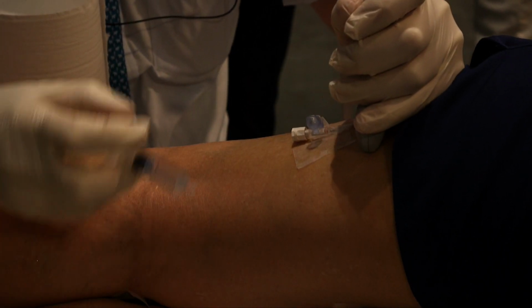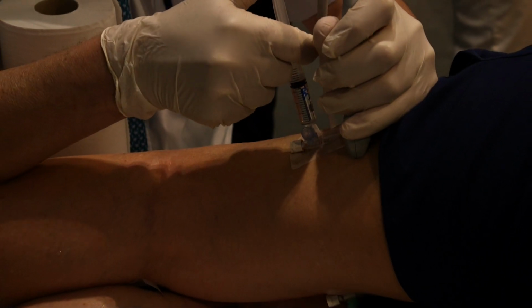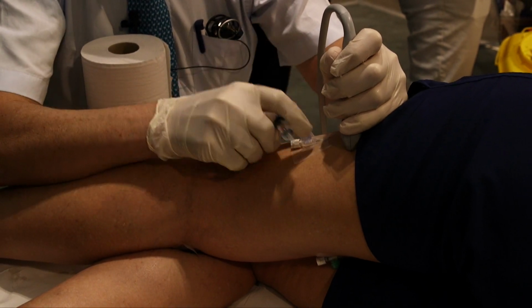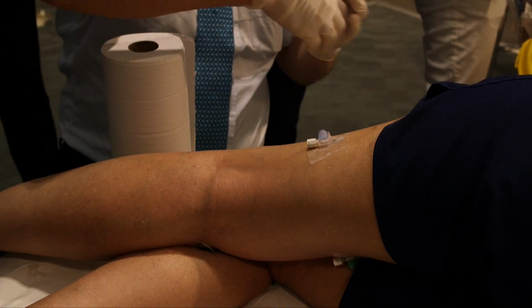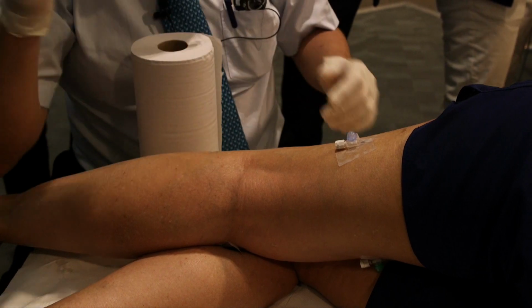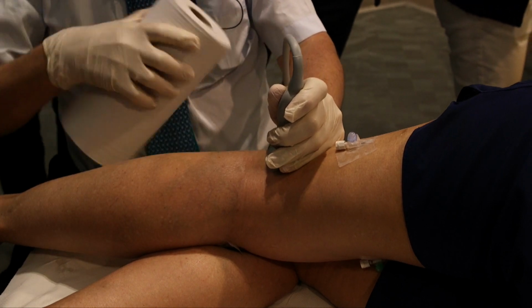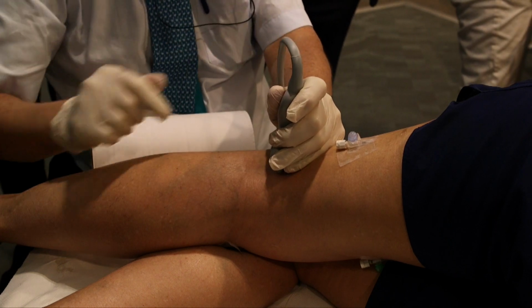Just to demonstrate that it actually did go into the vein, if I squirt the saline in there, what we don't see is it going into the tissues. It is going into the lateral thigh perforator, and then we'll just do some direct injecting into the varices. Could do this by eye. The trouble is I do ultrasound guided sclerotherapy as a routine. Two mils, 0.5% will be good, thanks.